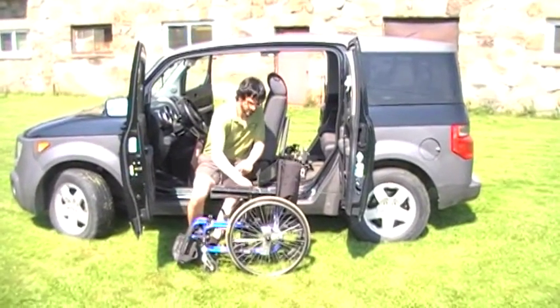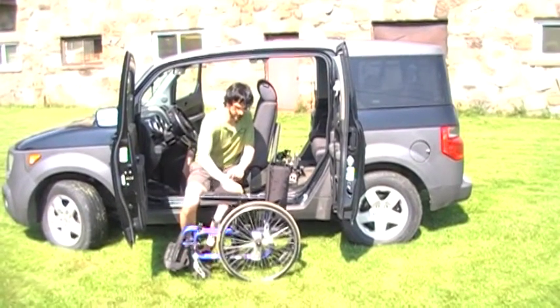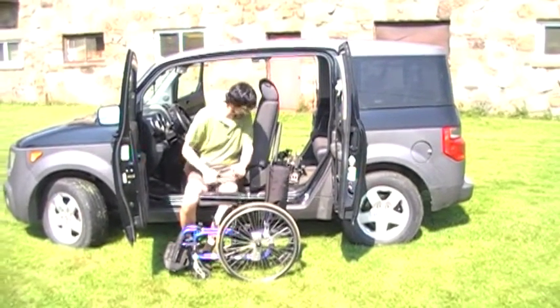Once we fold the wheelchair, we'll have some sort of a device to keep the wheelchair folded as we're going into a narrow space.